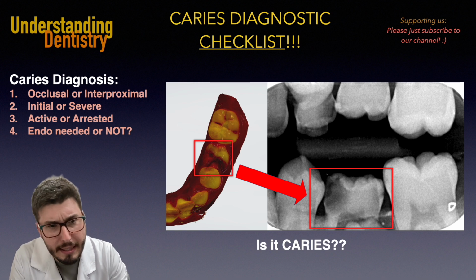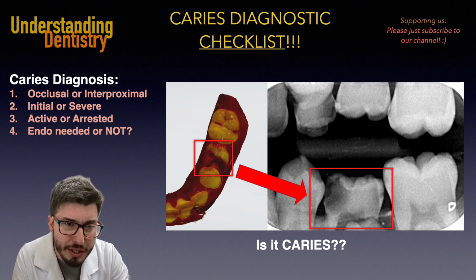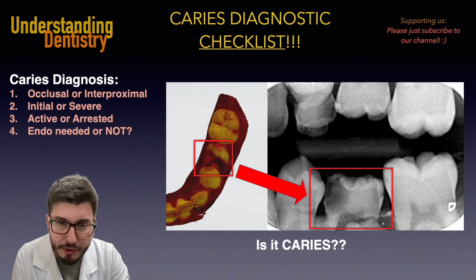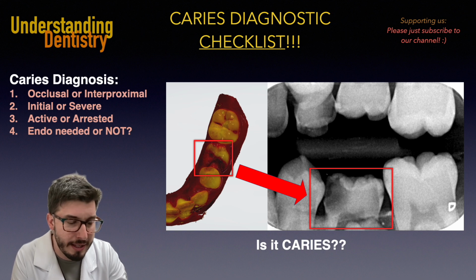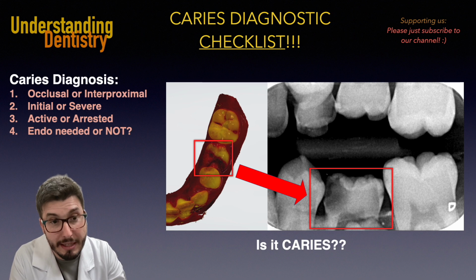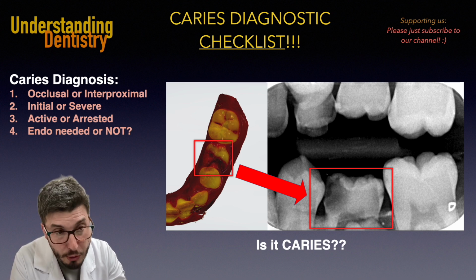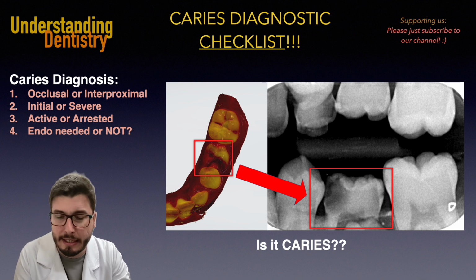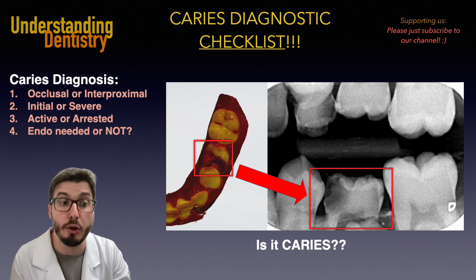You guys are seeing that there are some fissures, even class 5 caries were detected, but the radiograph is not contributing a lot for this diagnosis, right? Again, class 5, class 1 caries for you to detect in the clinical examination first, okay? Interproximal caries, yes. Then, so class 2, for example, that starts with the detection of interproximal caries, then yes, the gold standard will be the radiographs, okay?